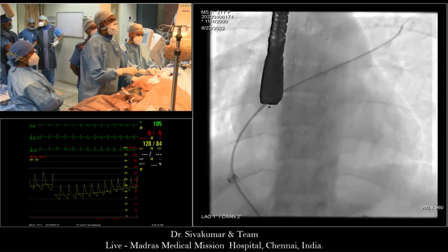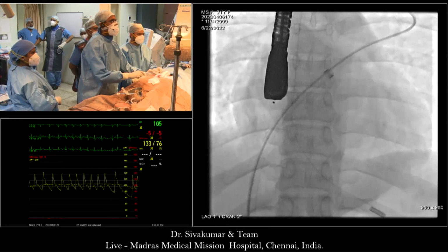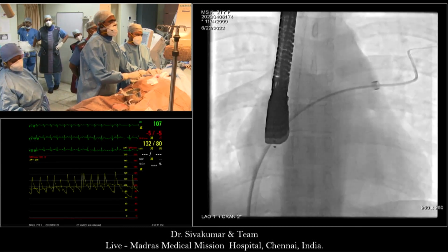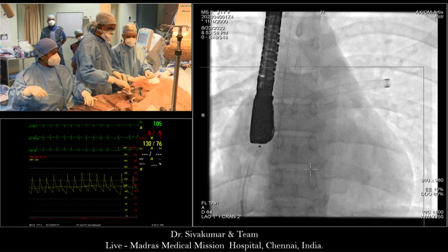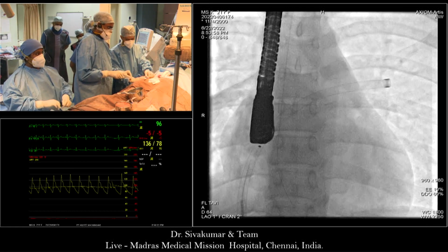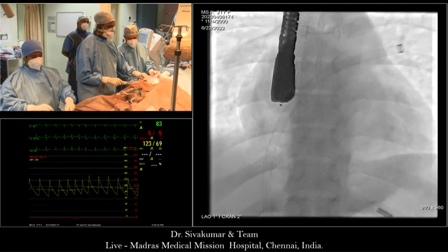Show the device. We're not going to disturb you, Siva.